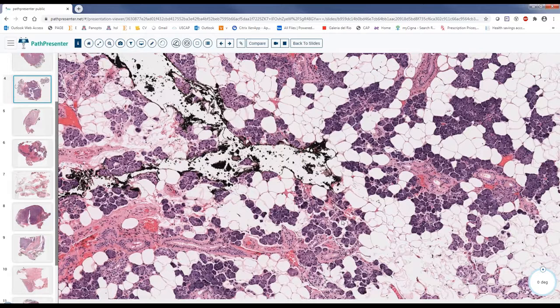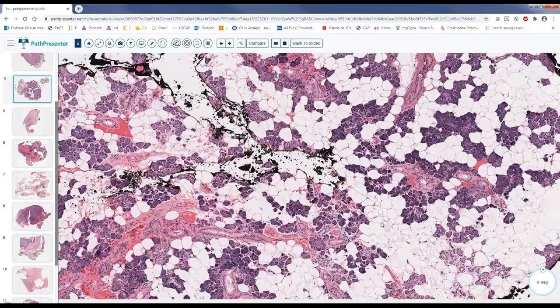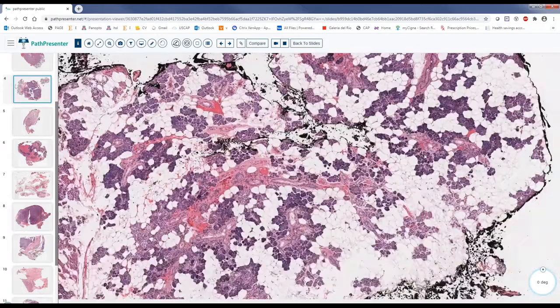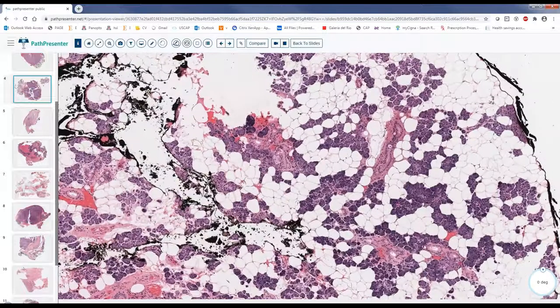So you guys see mixed? I don't see mixed. Maybe you're looking at these. These are not salivary gland lesions, not acinar. They are not the ones that secrete. They are ducts. So don't include ducts while you're discussing the type of acinar. So it is mostly serous. Excellent, Rabia. It is serous.